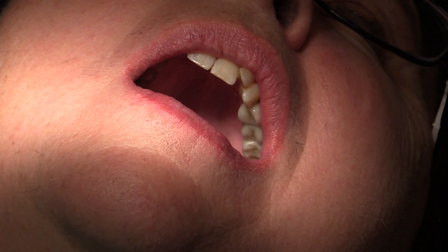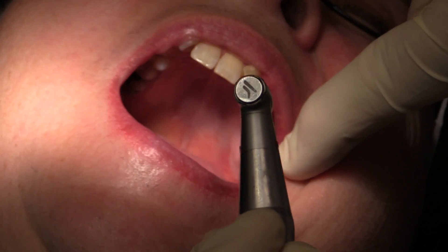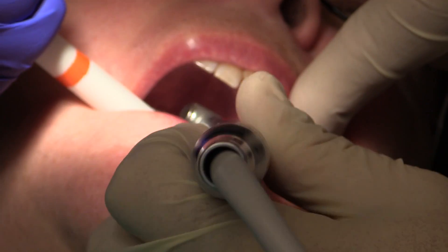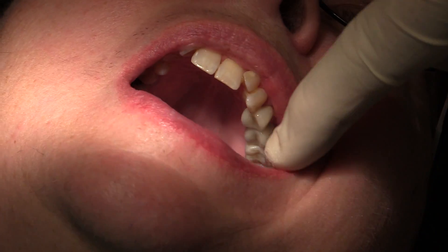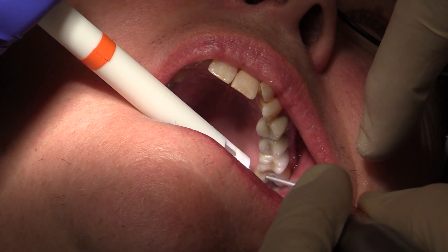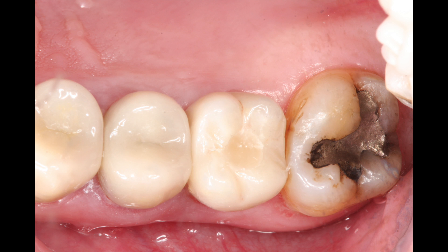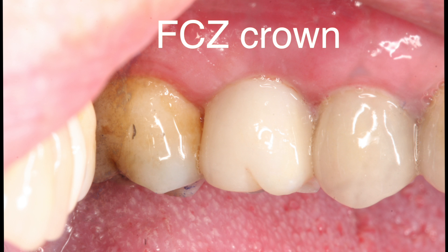I think it's going to be a real winner for patients. We checked the occlusion and it's sitting on the composite a little bit, so we're making sure that's out of the way. You're going to see a lot of these restorations done — the lab takes less time since no one needs to be adding porcelain. You do need someone with a good knowledge of occlusion to generate the ideal occlusal pattern. Here it is — it looks fantastic and I'm very happy with the outcome. This is Dr. Scott McLean and this is a YouTube video about implant dentistry.